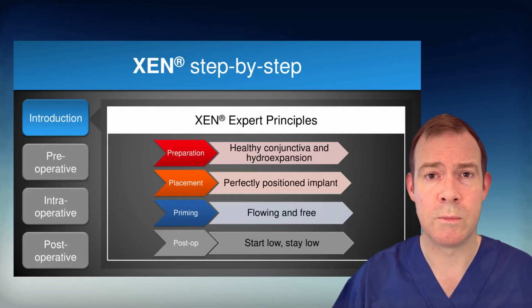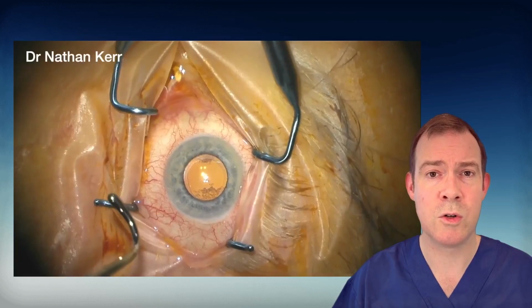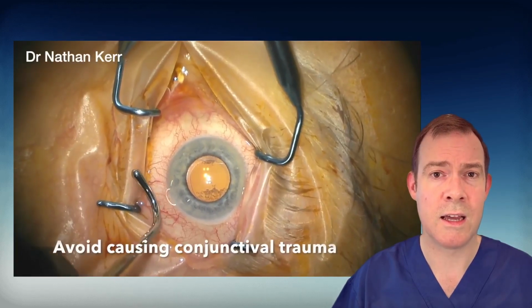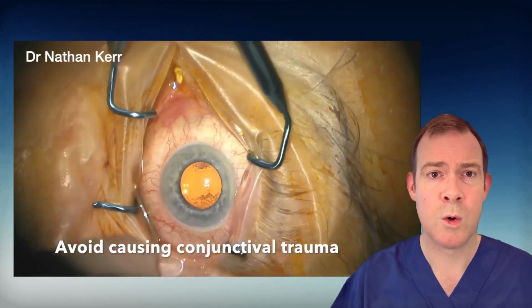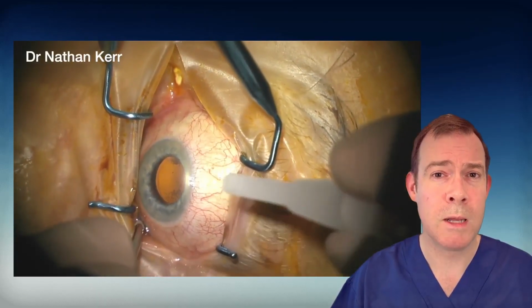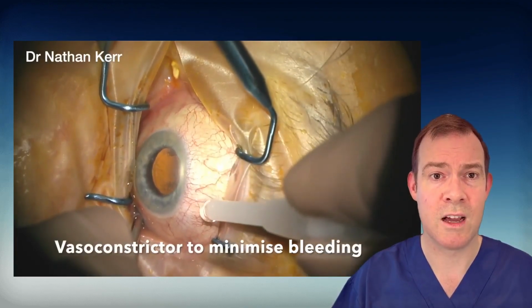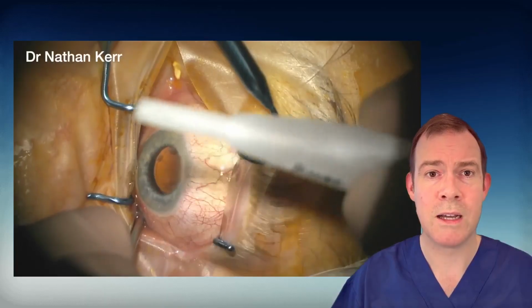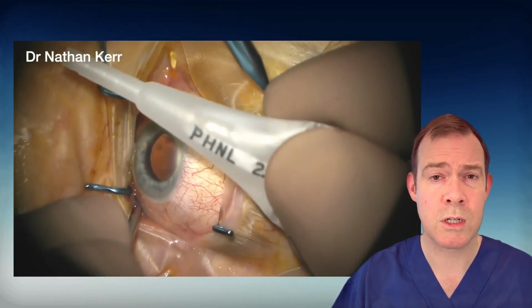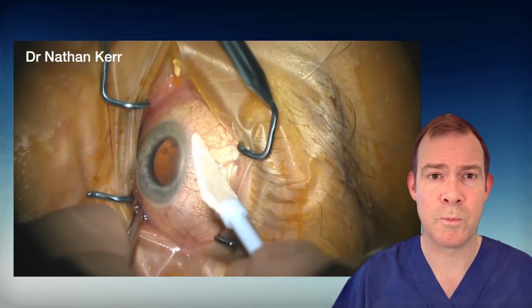In this case, we're performing a XEN surgery on the patient's left eye, and they're pseudophakic. We're using a nasal speculum to provide access. We want to minimize conjunctival trauma. Here I'm using a squint hook to manipulate the eye. We want to minimize bleeding, and a topical vasoconstrictor such as topical phenylephrine 2.5% can be helpful.